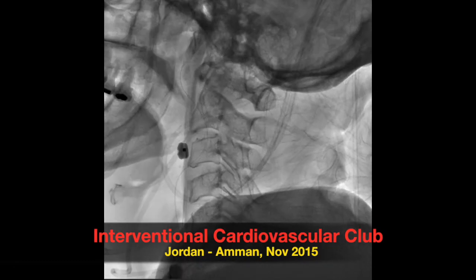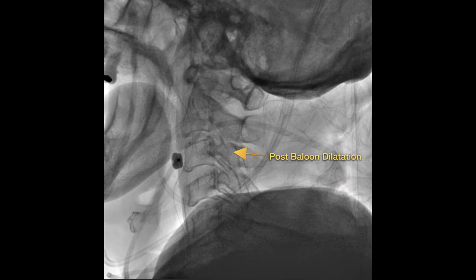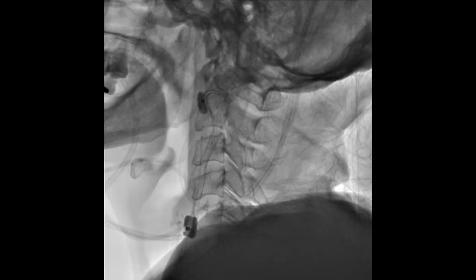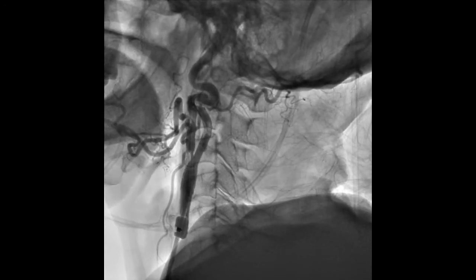But it's important to emphasize that the location of the distal balloon in the MOMA should be at the site of the origin of the external carotid. This is very important to prevent the collaterals from refilling the internal carotid from the other side of the face.